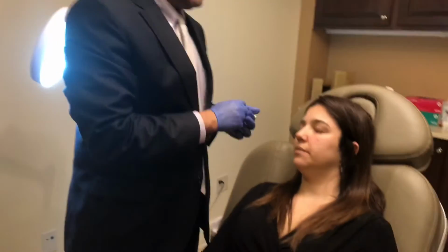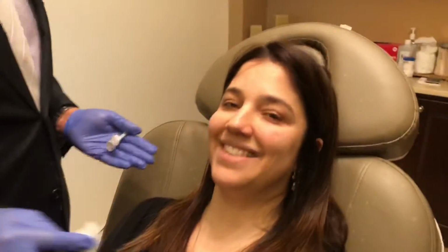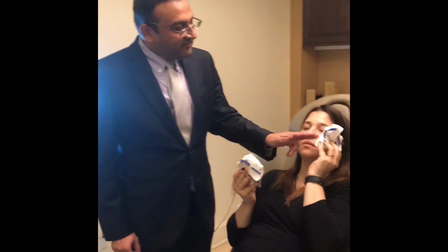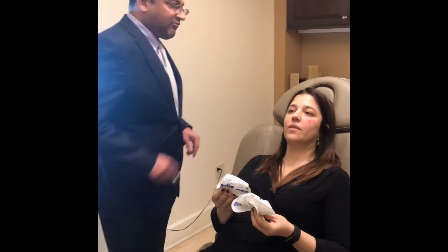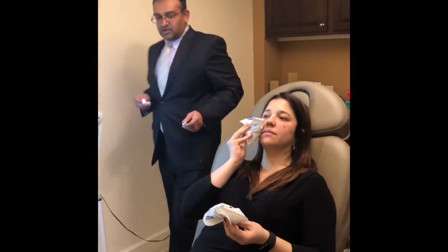And we're finished. And you are done. You survived. Again, you may have a little bit of tearing. It may feel a little bit funny, but as you can see, the results are immediate. She doesn't have any bleeding, just a little bit of this pinpoint, which we can wipe away. And she is done. So we just finished the treatment. Right now, Veronica is just icing the area, as you can see.